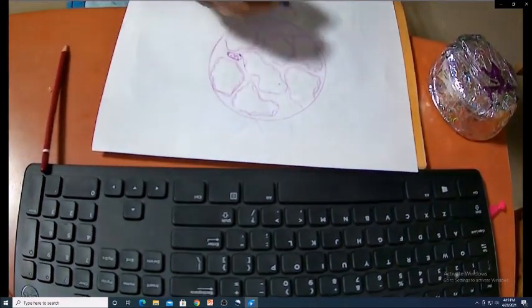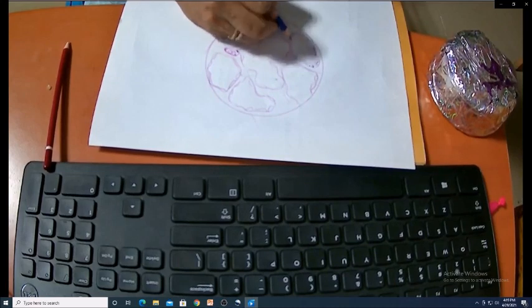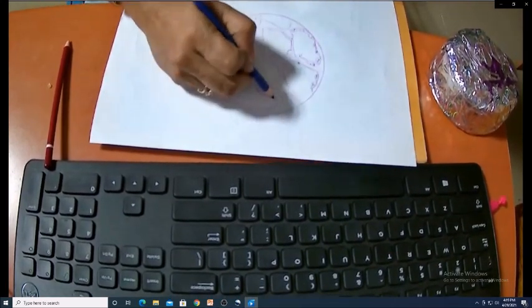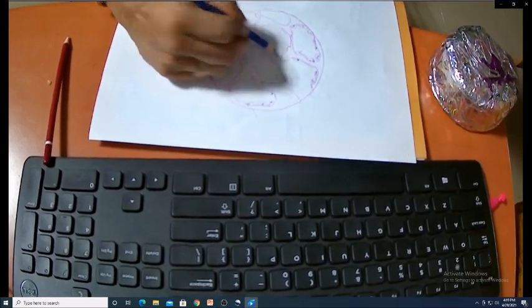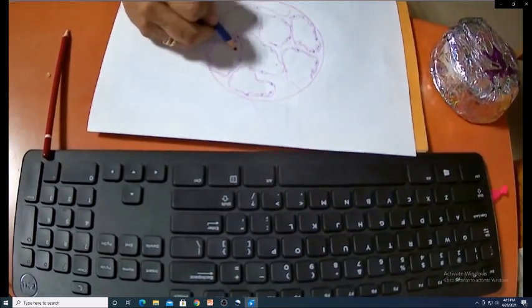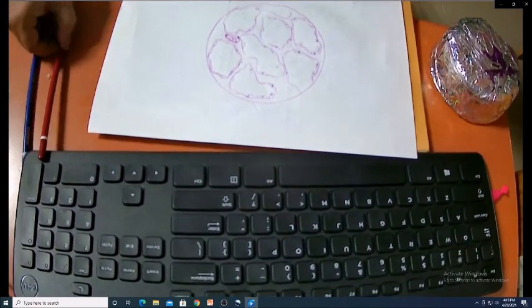Yes. So important is within the alveoli, we are going to write neutrophil exudate. We are going to show the presence of exudate. Okay. So I'm just writing the nuclei for the alveolar lining cells. Okay.